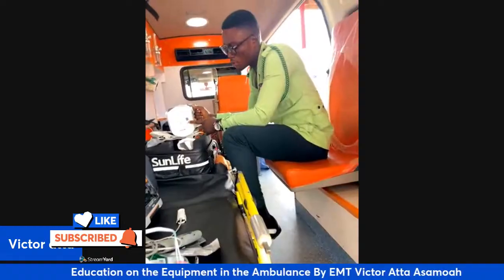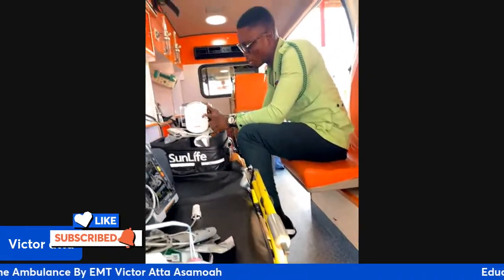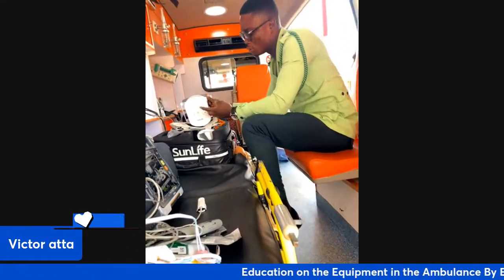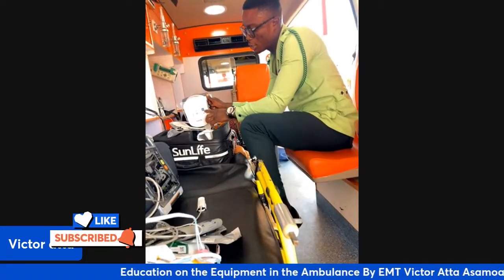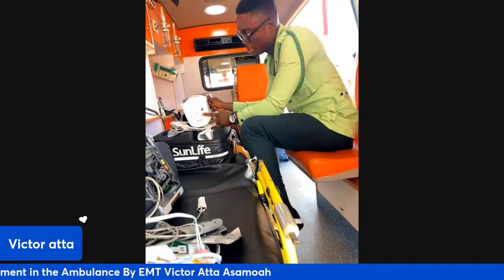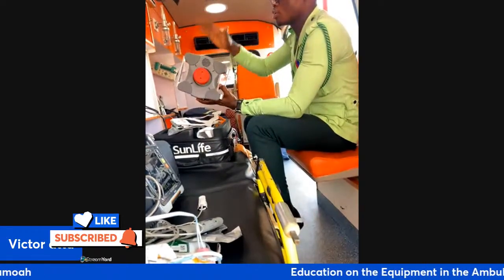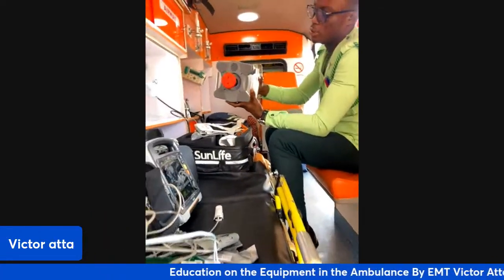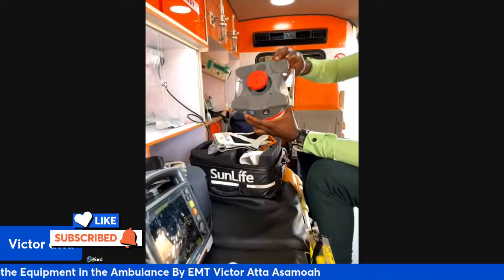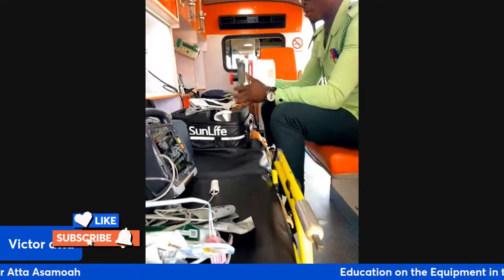You have the continuous one, and you have the 30 chest compressions. Continuous means when you are at one, the compression must be continuous, and when you are at two, you deliver 30 chest compressions and then 2 rescue breaths. This is a play sign. When you tap on the play sign, the machine gives its compressions. It's automatic.